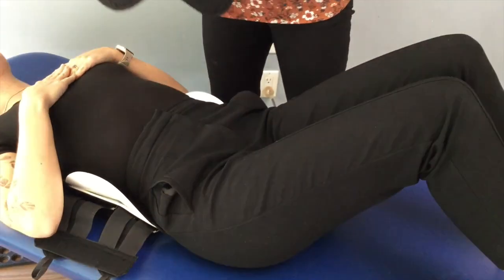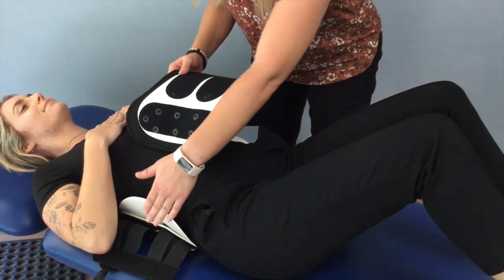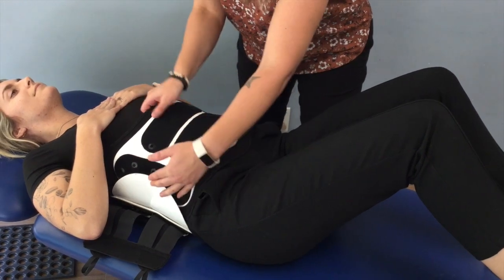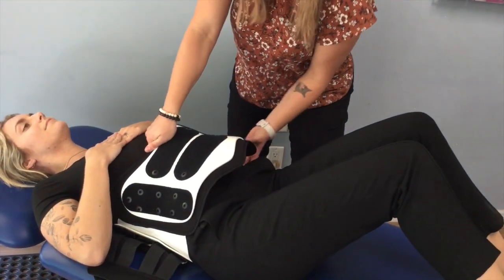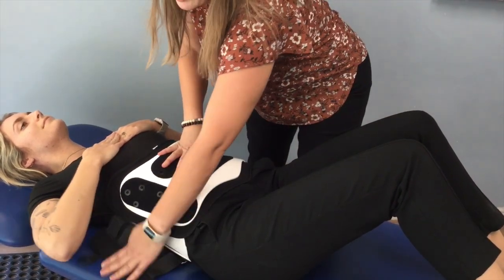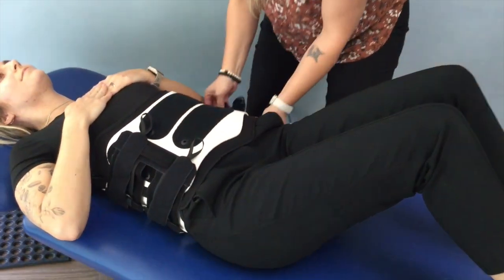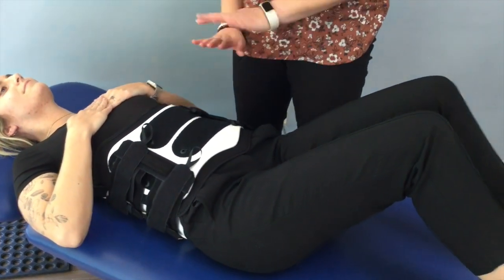We're going to apply the anterior shell. We need to ensure that we put the Velcro on the front of this shell correctly — we must not put the front piece inside the back, as you will not be able to attach anything to the plastic. So we're going to put the front over the back and hold it in place. We have some Velcro that will stick to the side, so we're going to apply that Velcro. The brace is now on her body, but she's not yet secure.